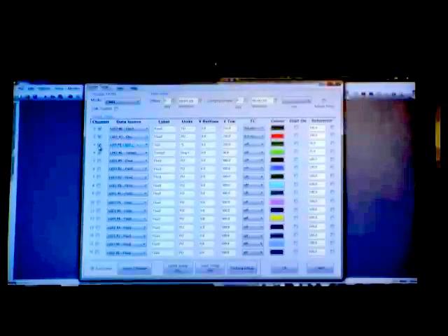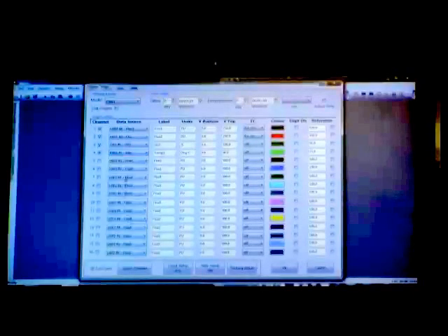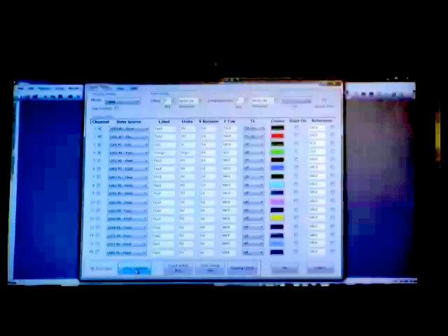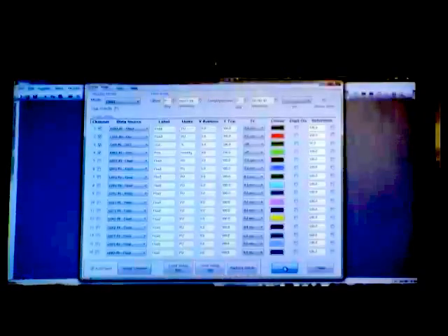The third channel we will output the tissue oxygenation data, and the fourth channel will have the pressure cuff pressure outputs in millimeters of mercury. So now they're all selected, we'll click OK to confirm the parameters which we'll be displaying.